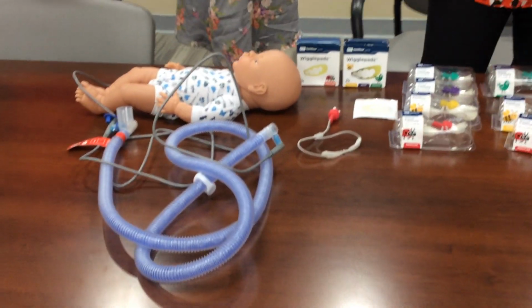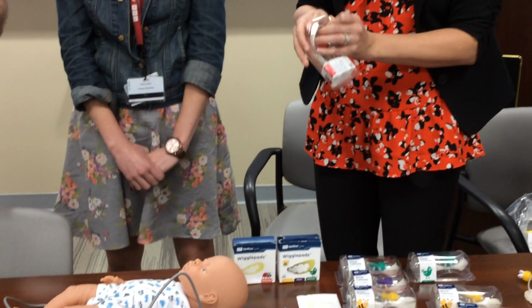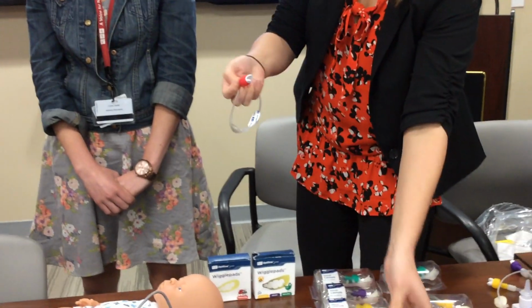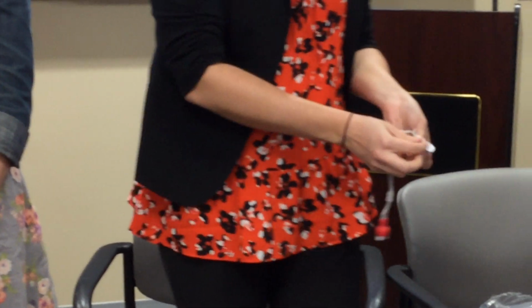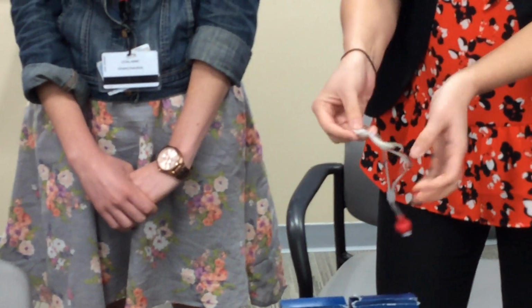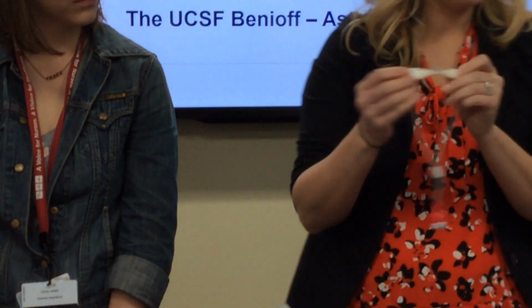There's a wiggle pad. So I'm actually going to take out a cannula and show you how to fit it. When you take it out, it already comes with the wiggle pad on. It's really similar to putting a Band-Aid on. You just slide one half off. You see there's another folded piece down there, so you slide one part off here, one part off there, and now you have a little bit of that sticky exposed.